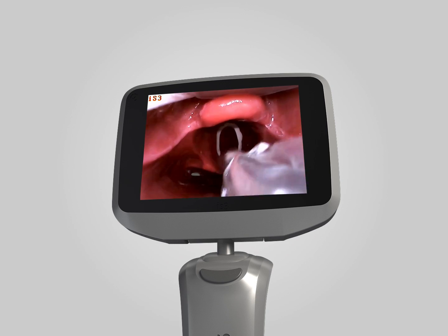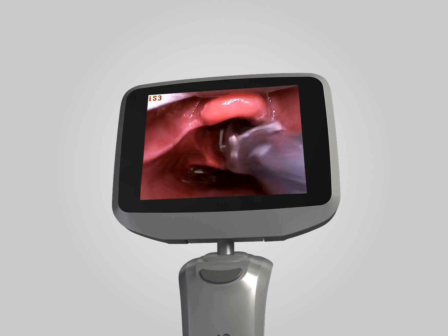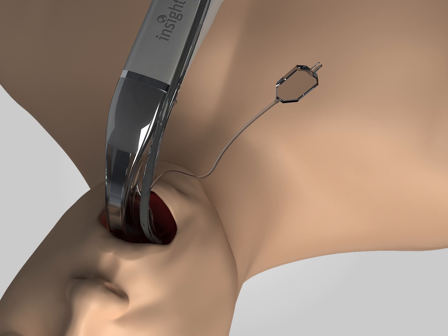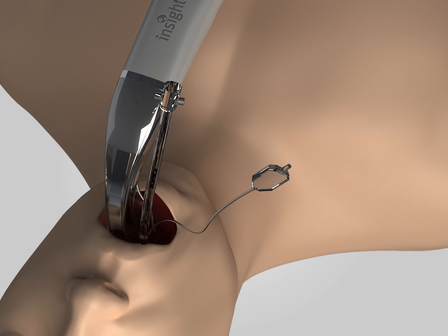Through the guide of the display, push the tube into the glottis position, exit the shaper, and then continue to push the tube to complete intubation. You may need to exit the tube, reshape, and then insert it under special circumstances.